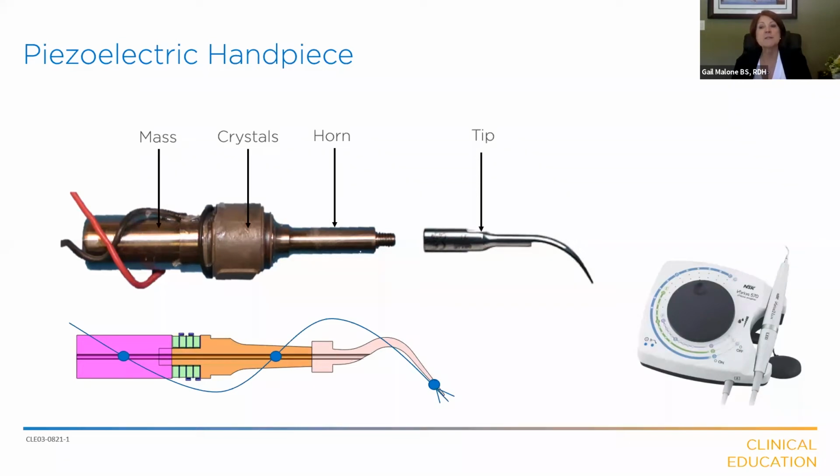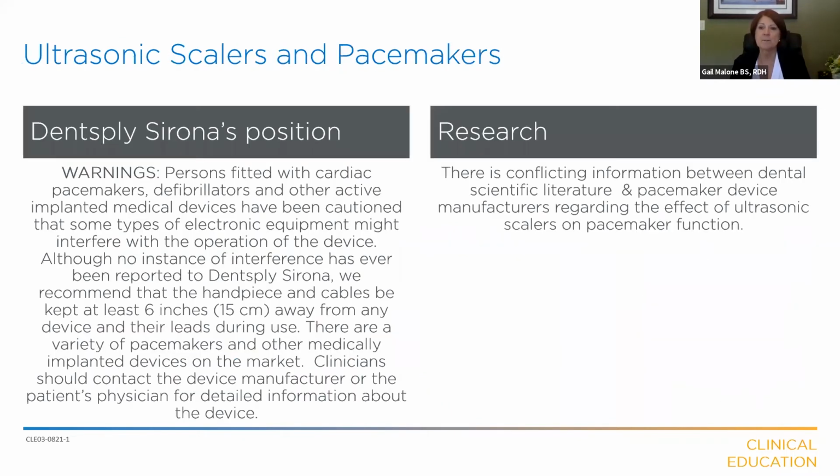Now, this slide completes the overview of the fundamentals of the two technologies. In this next section, we'll briefly review the considerations for using ultrasonic devices with patients who have implanted electronic devices.